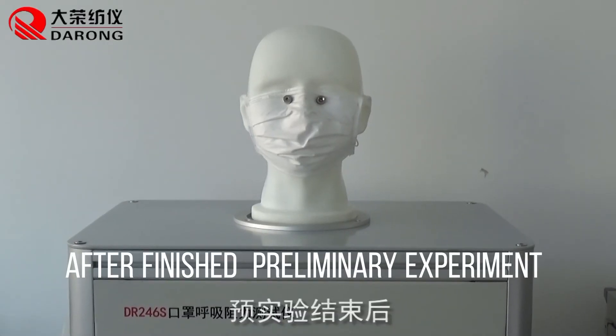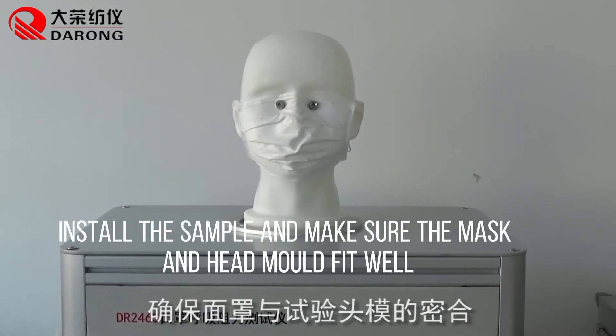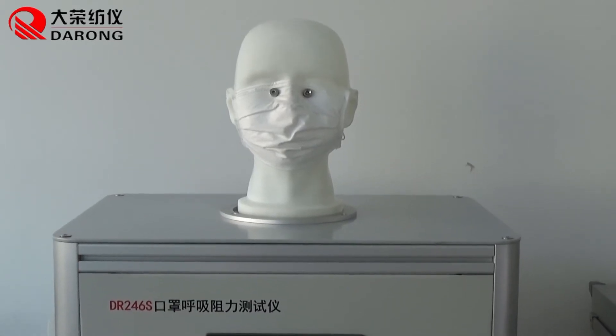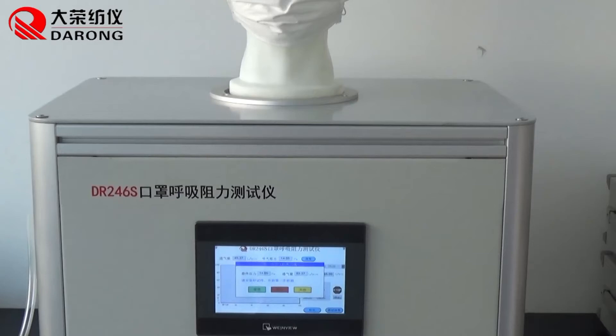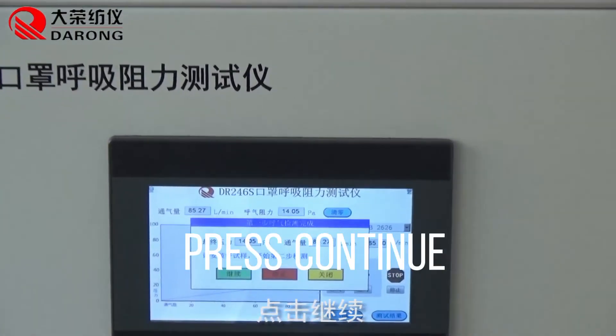After finishing the preliminary experiment, install the sample and make sure the mask and head mold fit well. Then press continue.